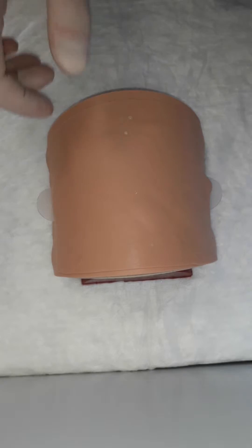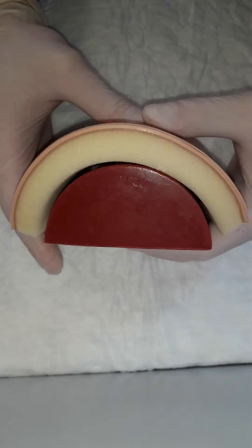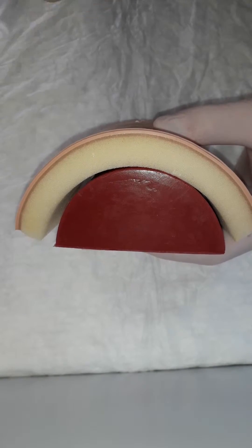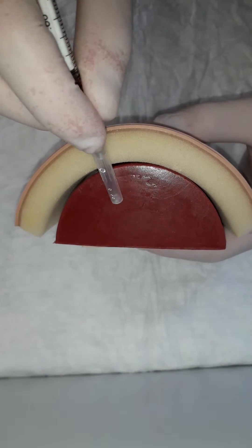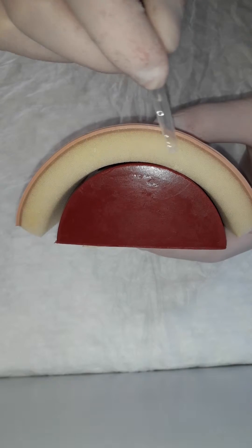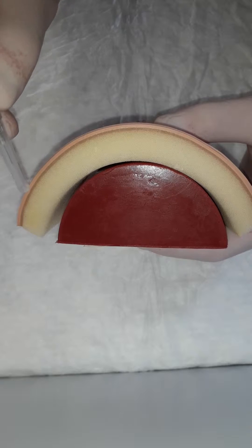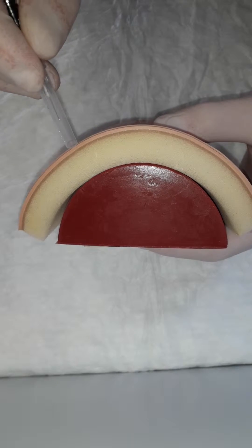Before we start, I just want to show you this small shoulder model. Here you can clearly see three different layers. The red one is muscle, the white or yellow one is subcutaneous tissue, and this thin, most superficial brown layer represents the intracutaneous layer.